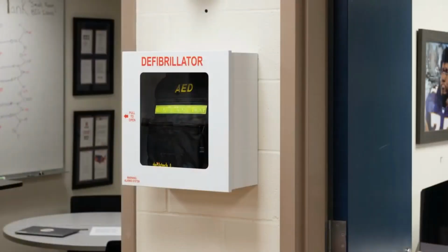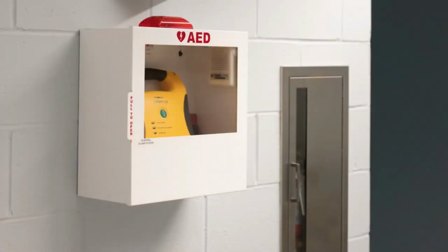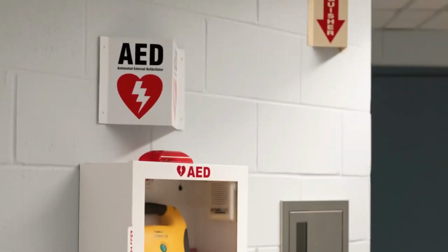The cabinet should be very visible and always accessible. It should be unobstructed at a maximum height of 48 inches from the floor, so anyone can go grab the AED when it's needed. Lastly, we want to make sure it's visible, with a three-dimensional universal AED sign above it.